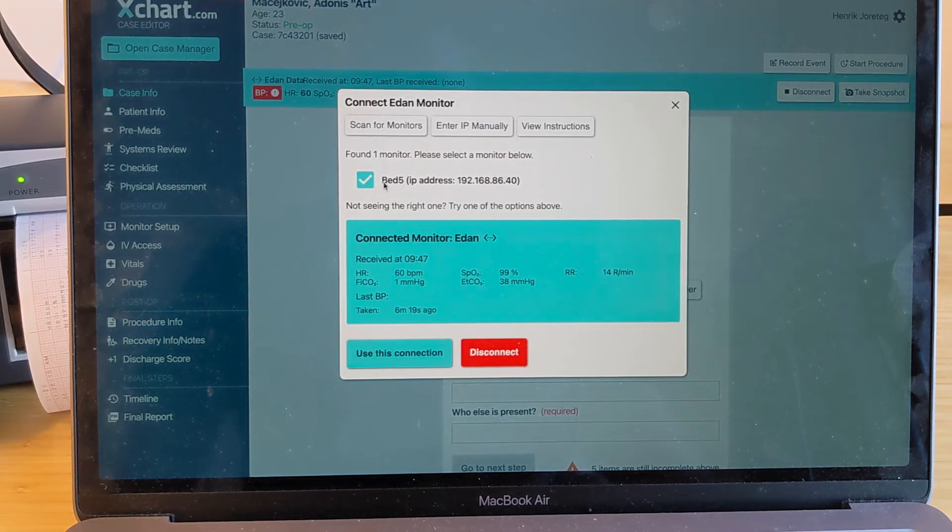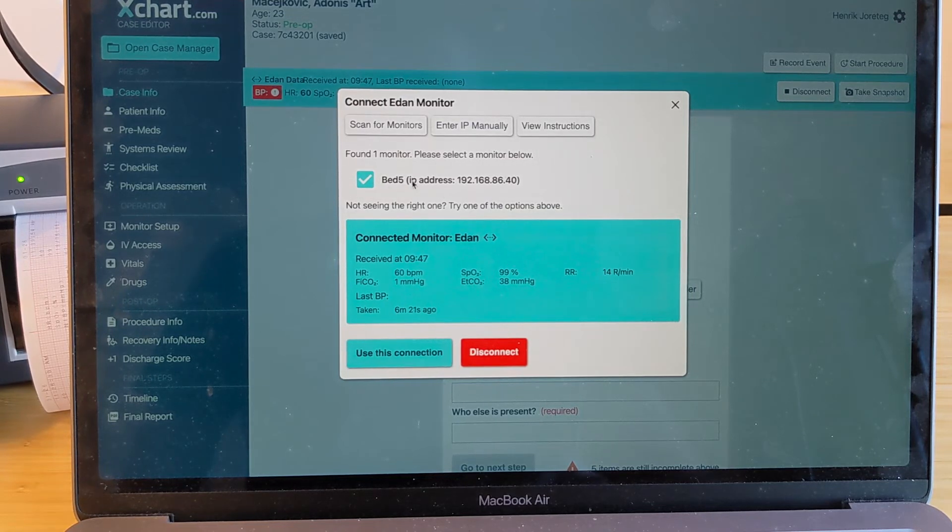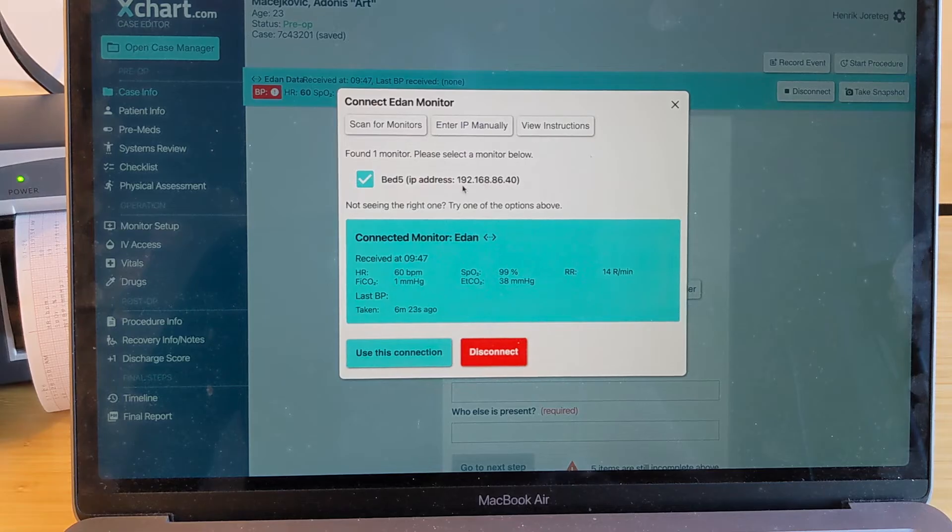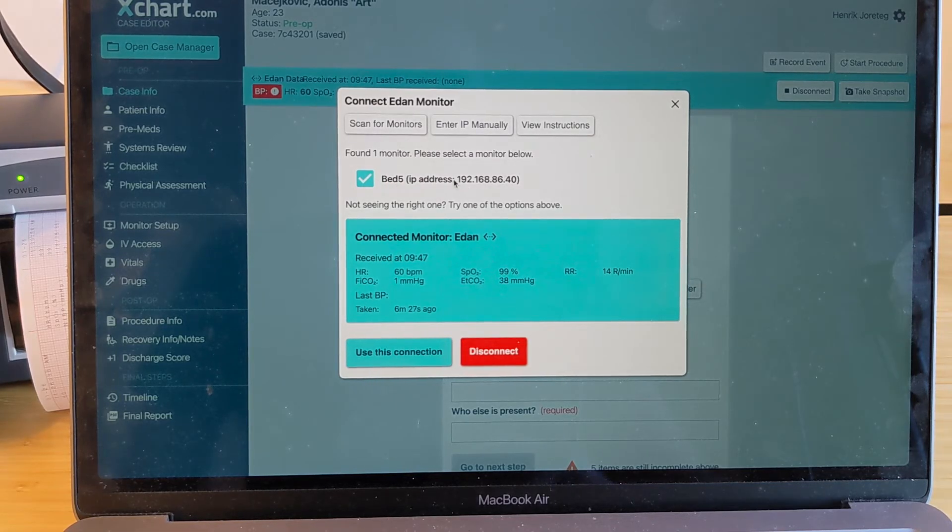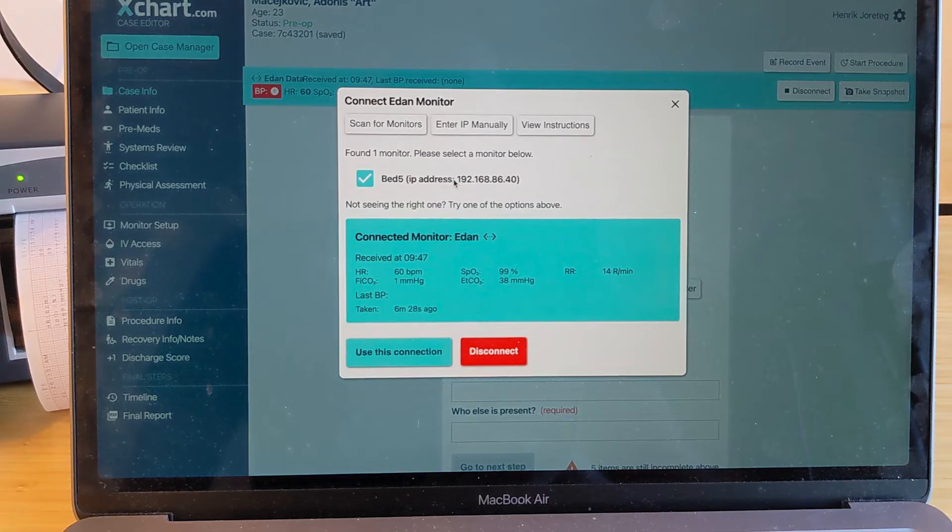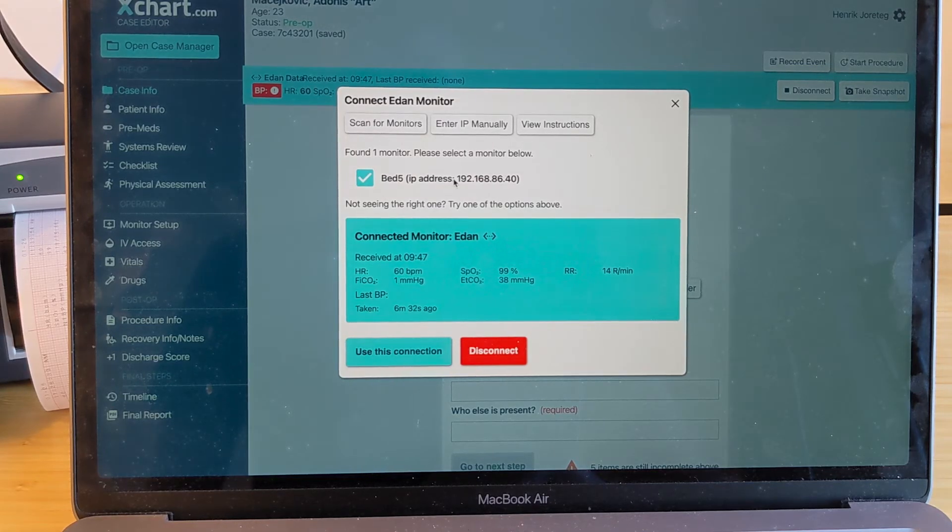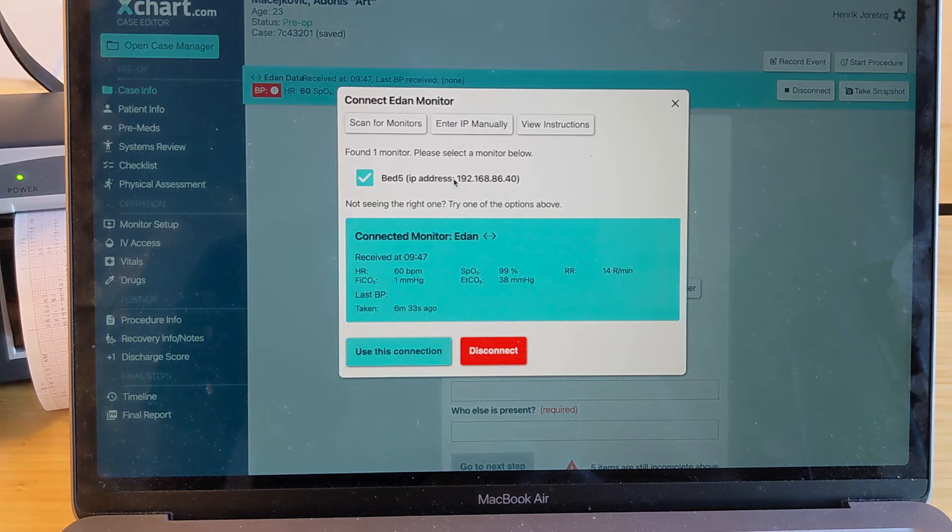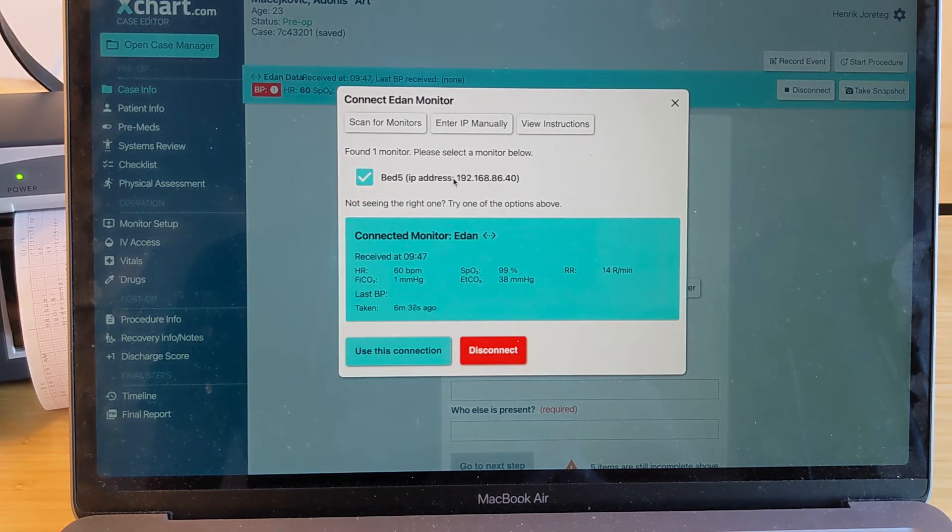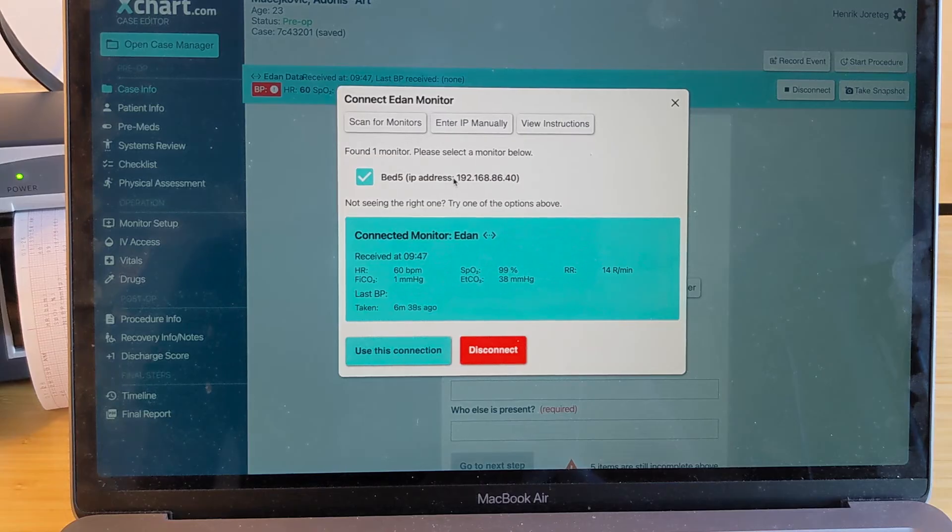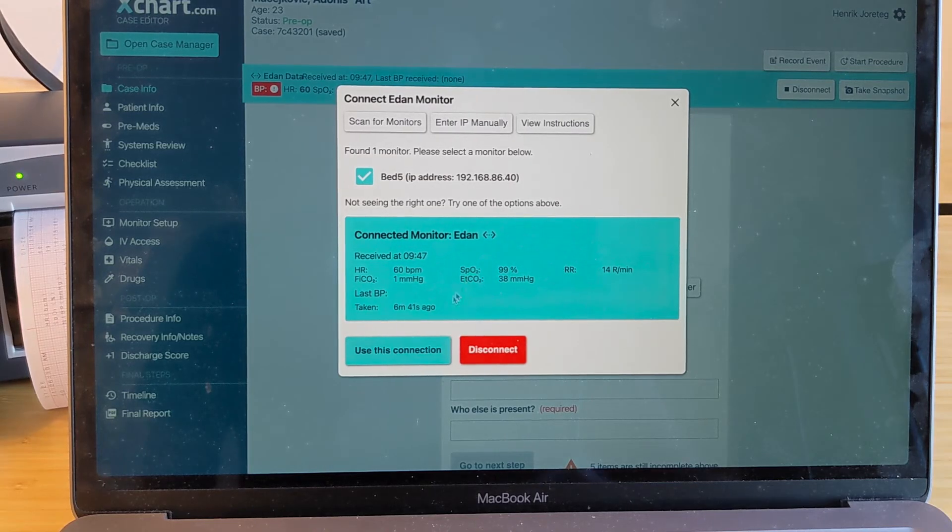And notice that it says the bed number here as well, as well as the IP address of the connected monitor. So you can confirm that it's the right bed number. If you have multiple monitors, you'll want to refer to the section of the video that references how to set the bed number on your monitor. You want to make sure that each monitor in your office has a different bed number so that you can clearly differentiate them.